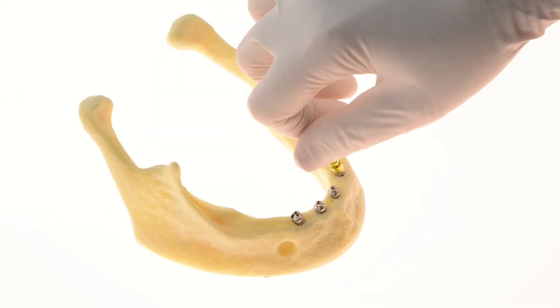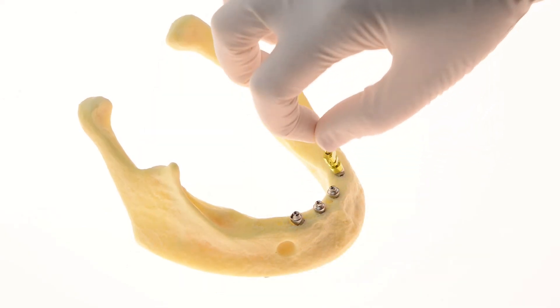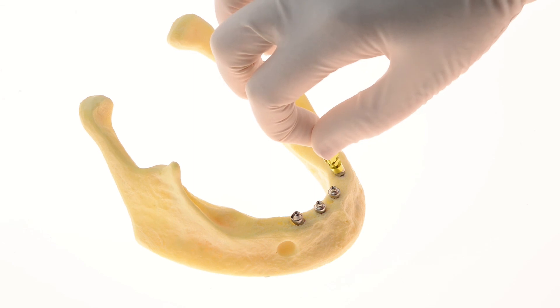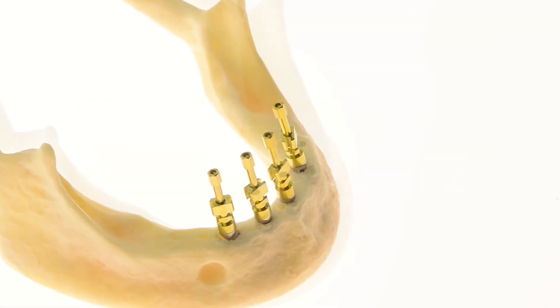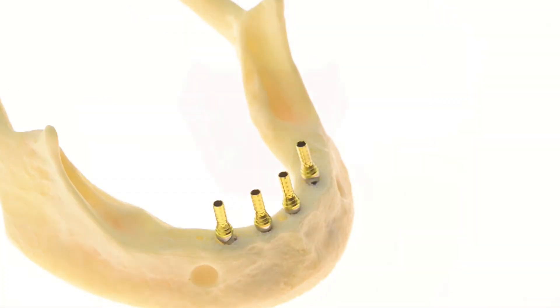You may now connect the impression copings and an impression may be taken. The next step would be positioning the provisional abutments. We are now ready for provisionalization.